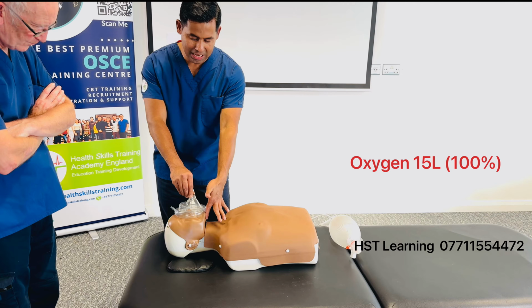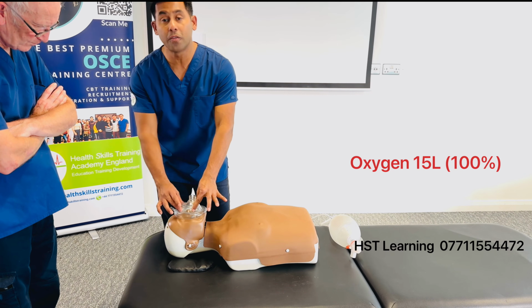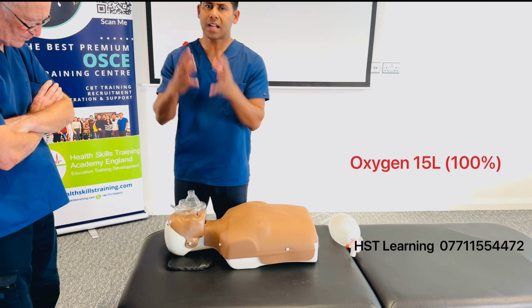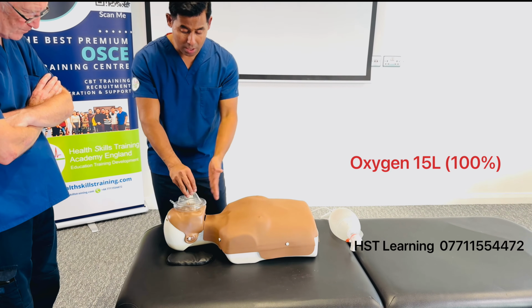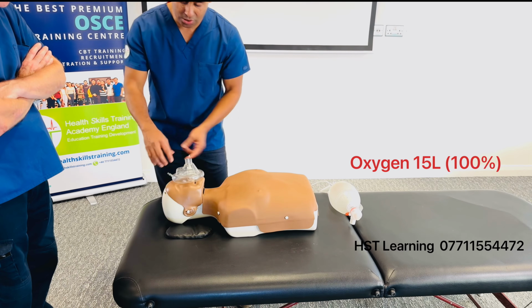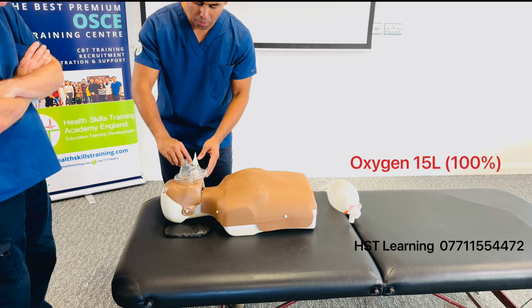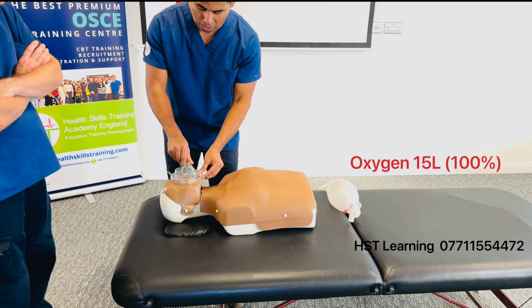If you look, in line with the chin there, and it's sealing the nose, it's a perfect size. It's not too small or too big. You don't need to worry about the size here. Normally they have the right size, but make sure it is sealing properly. So put it nicely. It is a triangle end, and sometimes if they hold it that way, it is your responsibility to make sure the mask is the right way around.